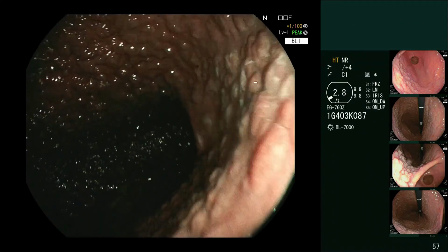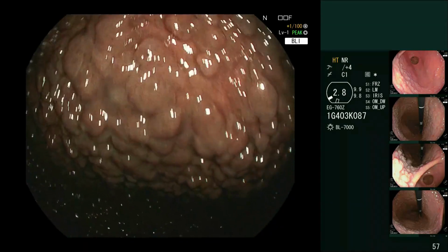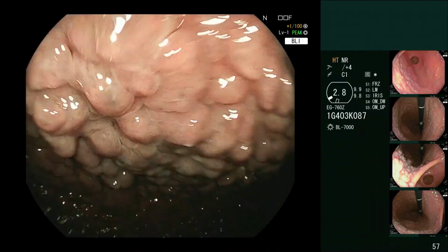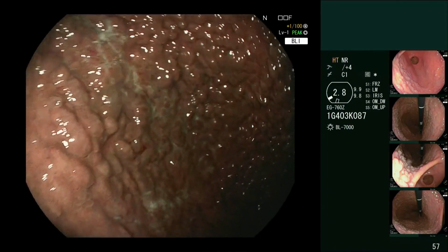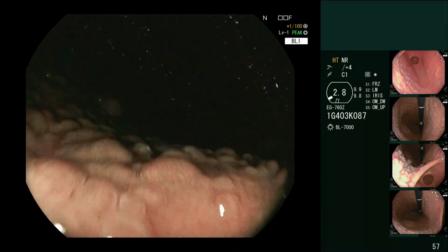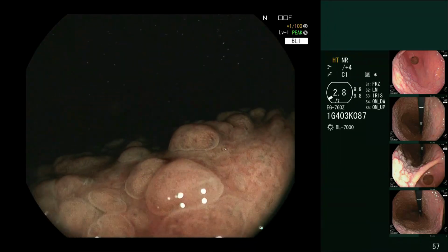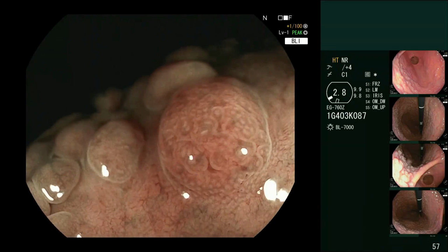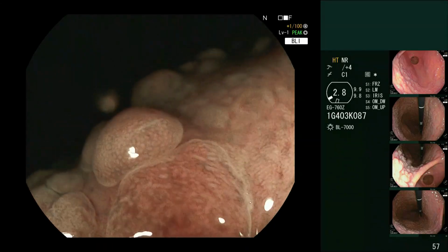So you want to put a cap on for this. I'm not going to for the purposes of this demonstration video, but you can look at any of our videos to see the benefits of a cap in terms of imaging. You'll see it here as well, because I am not able to adequately image these things because it's moving and I can't maintain the focal length. I can do it a little bit, but I can't do it perfectly, right?